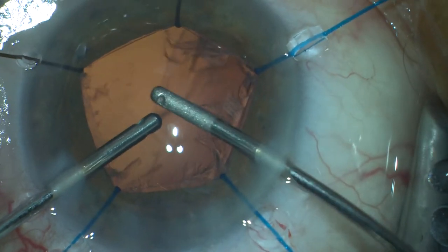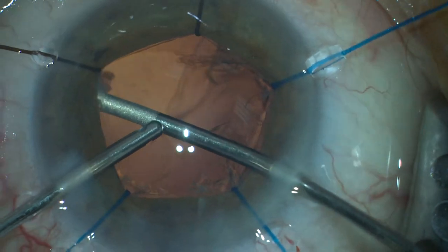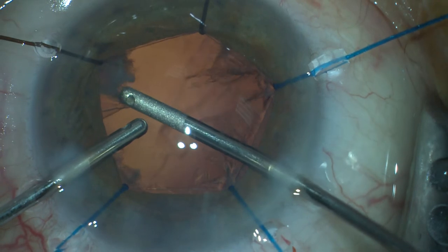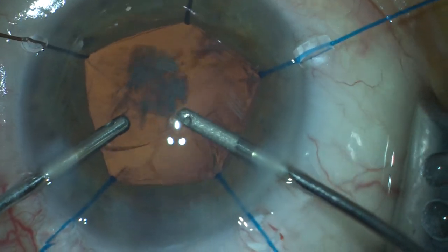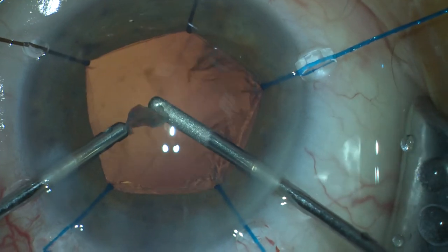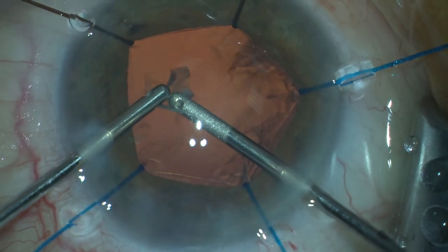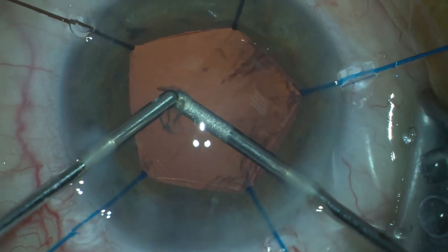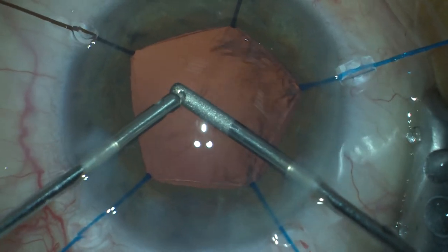At this time you can see the aspiration of the remaining cortex. And you can notice that this is a particle of the remaining lens nucleus material.